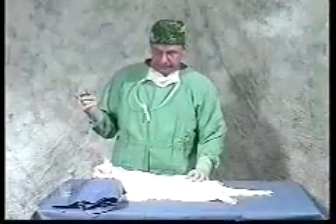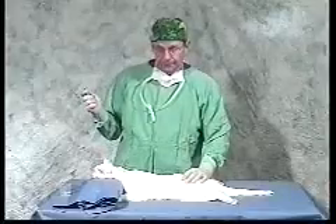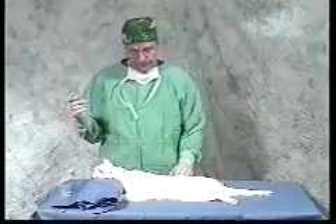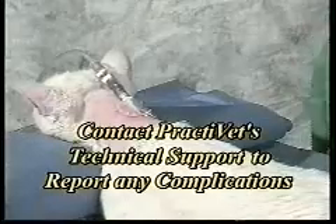We are running enough just to be sure everything is going fine. I like to add 500 mg of cefazolin to the first bag of fluids used in surgery, and I send that bag home with the client as the first bag of fluids they are going to use — just to cover any infections that we might have pushed in through the skin. Infection control in this system is very important. These tubes can remain in place for up to a year if we don't get a low-grade infection. A low-grade infection tends not to be reflected in the patient's condition, but the body will wall off the tube and develop a little tunnel where fluids accumulate and run back out the port — something we want to completely avoid.